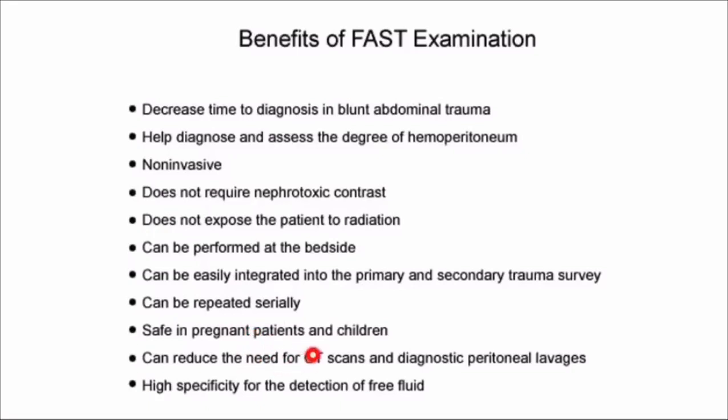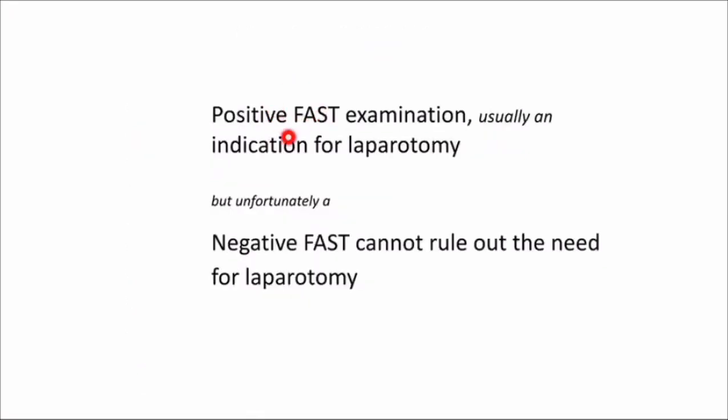It usually reduces the need for CT and diagnostic peritoneal lavage procedures. And of course, it's highly specific for detection of free fluid. A positive FAST examination usually is an indication for exploratory laparotomy, especially in the setting of a hemodynamically unstable patient. But unfortunately, you should remember that a negative FAST exam cannot rule out the need for laparotomy.